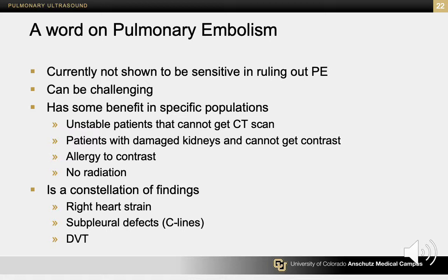Pulmonary embolism can have a similar sort of appearance. But if you imagine we're imaging a large surface area for a very small finding, it can be really challenging to locate that area. And if you didn't find that particular area, you could call something negative that is potentially positive. So it can be a little bit challenging to find what you're looking for.